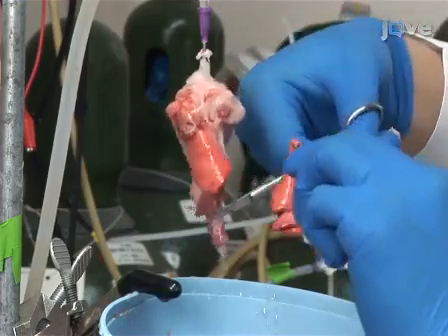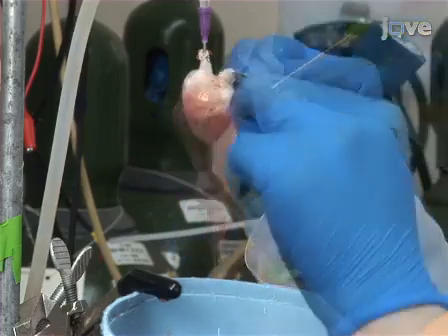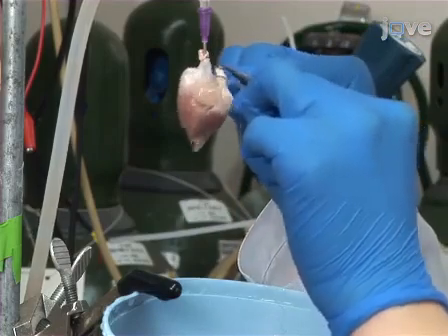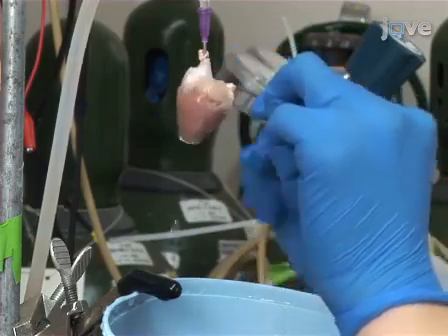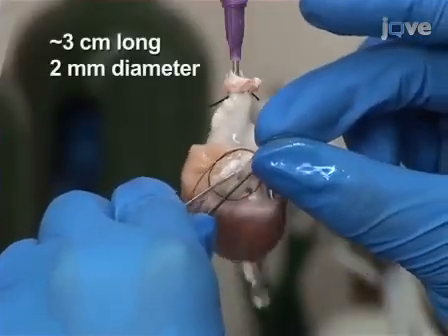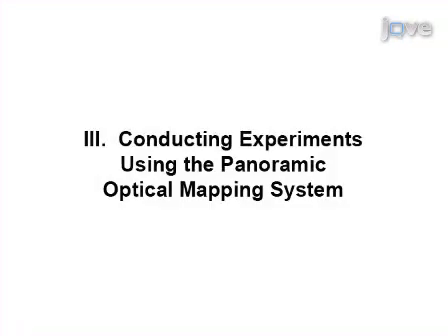Then remove the lung, trachea, fat surrounding the heart, and connective tissues. It is very important to prevent fluid buildup in the left ventricle, which would produce ischemia. So, insert a silicone drain tube through a pulmonary vein and mitral valve and into the left ventricle. Now move the heart with the cannula to the recirculating Langendorff-perfusion system, equipped with optical mapping system.